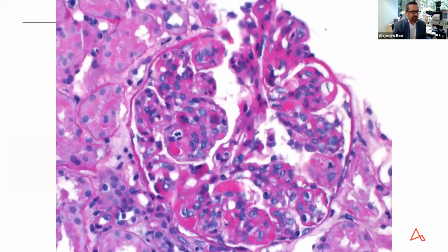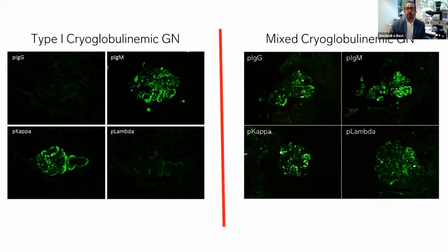The morphology that I mentioned, no need to repeat it, an MPGN with hyaline thrombi. Sometimes you can see subendothelial deposits as well. All right, so it's really difficult. We can make a diagnosis of cryo, but we cannot always make a definitive diagnosis of the type of cryo.